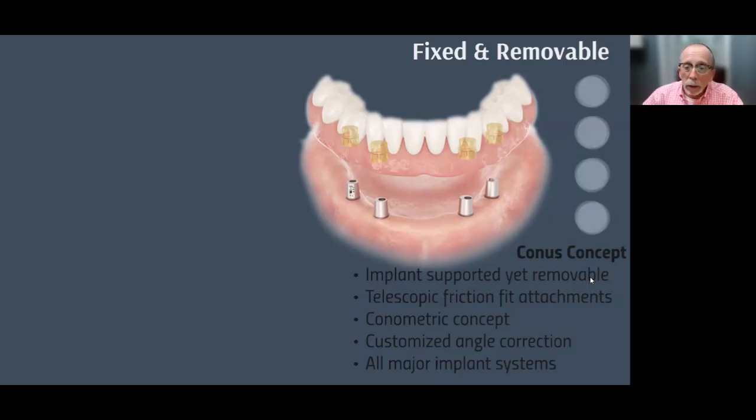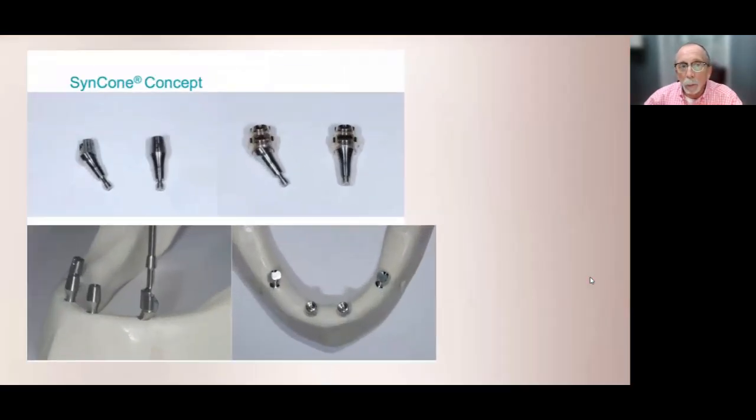It's a fully customized abutment, which it has to be because for this thing to work best, all the abutments have to be parallel. You have to have 4 abutments. I've seen it done with 6. I don't know that it necessarily needs 6, but you could put 4 or 5 in here and that's okay. They make this for any major implants, fully FDA compliant and works really well.